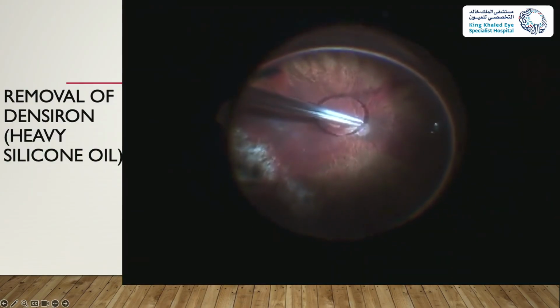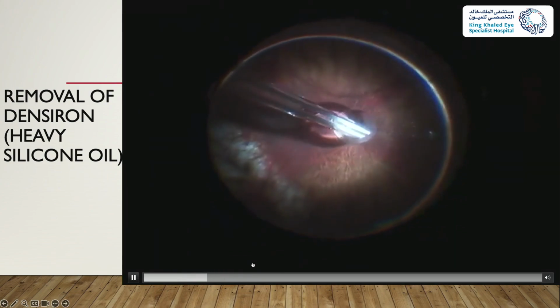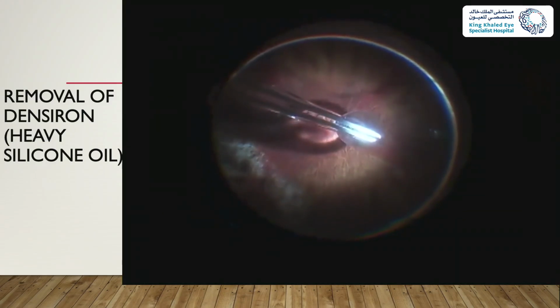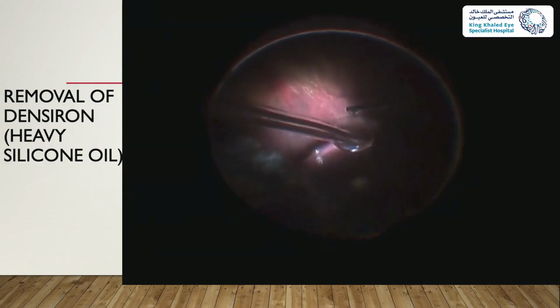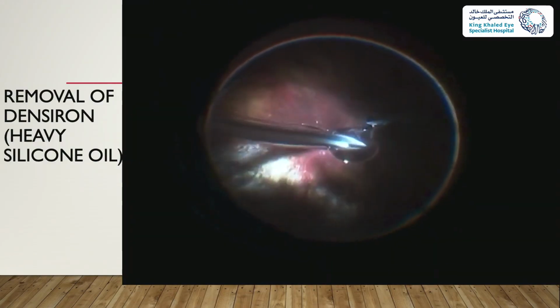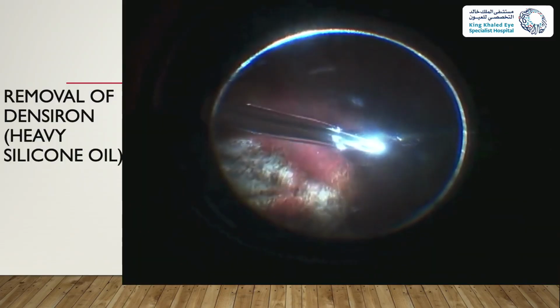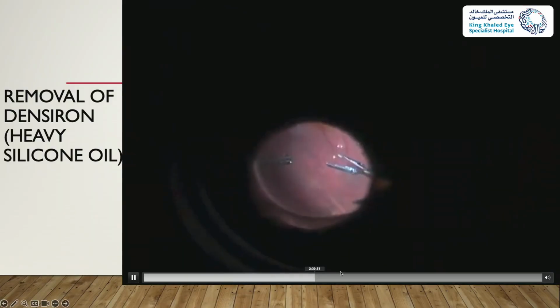So you can see, you can bring it down to a smaller volume, and then it will stick to the cannula, and you can see it there in a minute, and then you can use your light pipe to migrate it. See, you're lifting, getting it out, and you can just use the light pipe to guide it to the tip, and then you can aspirate. It will just stay in that area. So that's one technique that I was using before to get rid of the stuff.